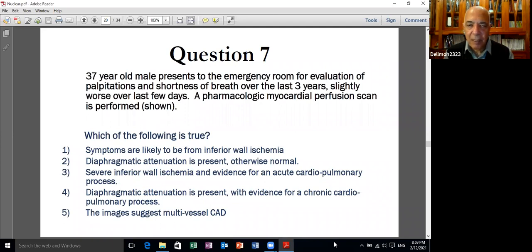You can test by viability study something like thallium redistribution. You give thallium, you image after certain intervals, and if it takes the thallium, it means the membrane is intact. But as I told you, this is insufficient. Why? Because to get viability, you have to have normal blood flow, you have to have intact cell membrane, you have to have intact mitochondrial membrane, and you have to have intact enzyme system, or what we call the metabolic machinery. And these are tested by the glucose analog, not by the thallium. So thallium is no longer used for viability, but that's not enough.